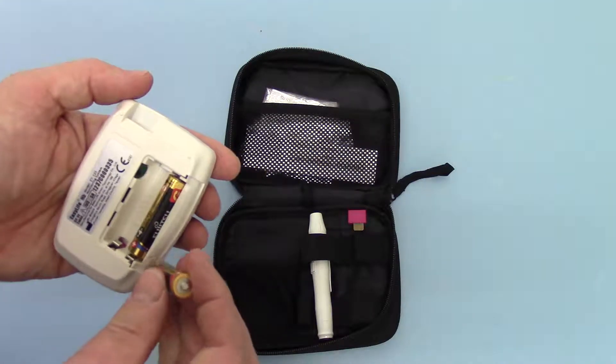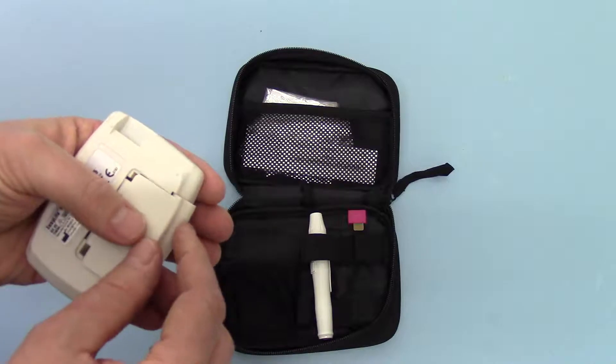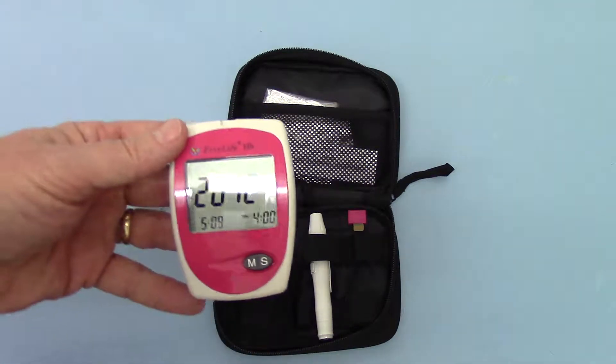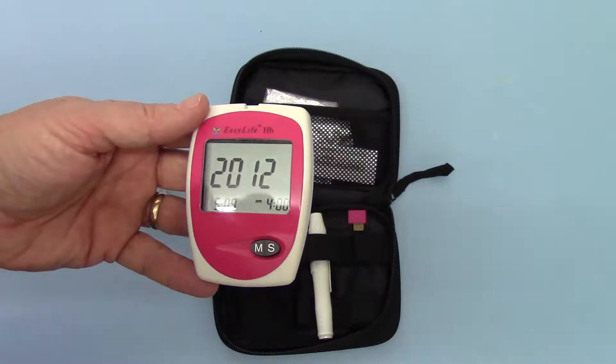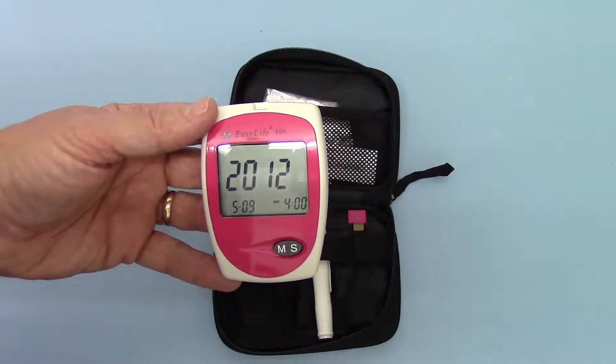I'm just going to pop the second battery in here. Close the battery compartment. Turn it over and you'll see the default setting showing on there. Let me just get it so you can see that on the screen without too much in the way of reflection.